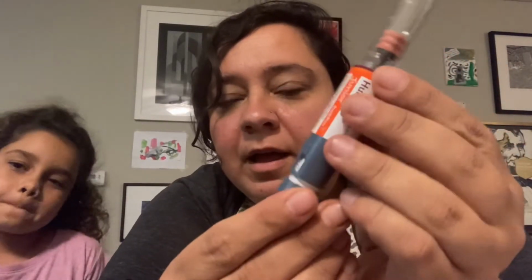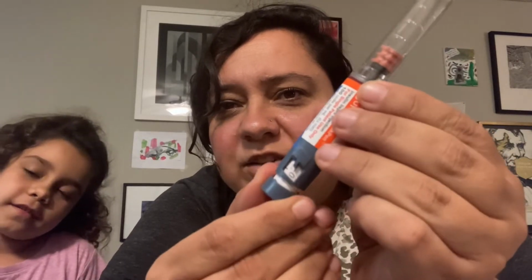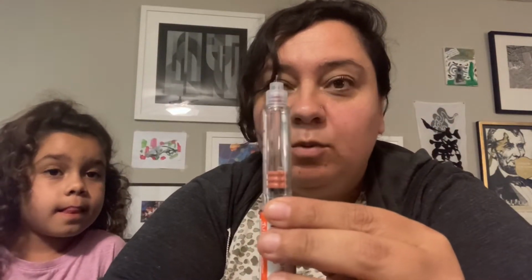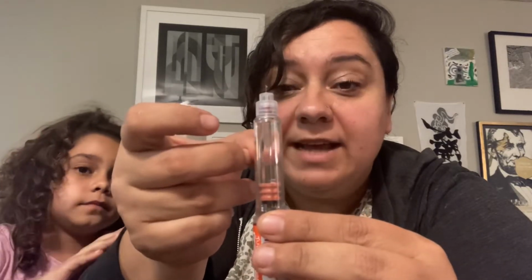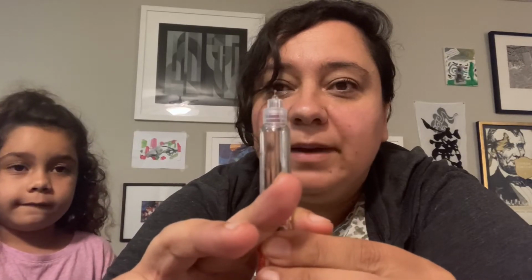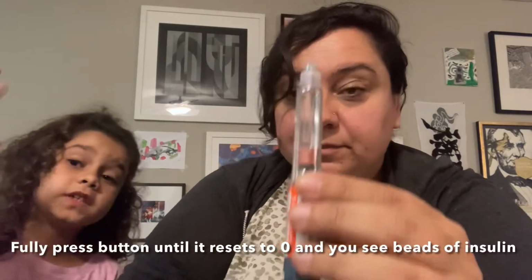Okay, so now I'm going to prime the needle. It's at 0. I'm going to turn it to 1. So that's 2 clicks. And now you can see it's on the 1. Then I'm going to hold the needle upright with the needle pointing towards the sky. I'm going to flick it twice, and then I'm going to depress until you see insulin coming out the top. But just remember, kids, that flicking and handling all the sharp parts of this needle is a job for a grown-up to do. For kids, it can be very dangerous.